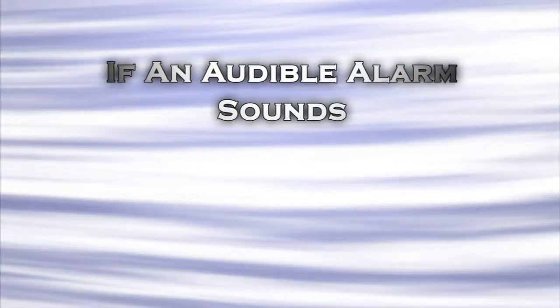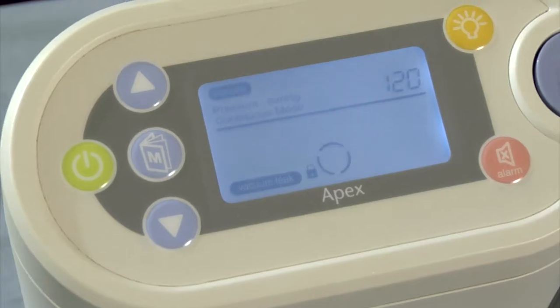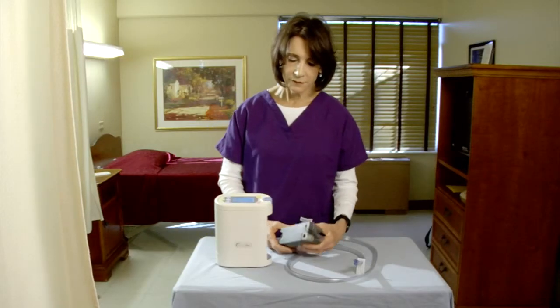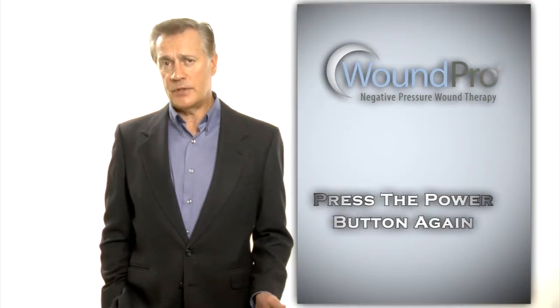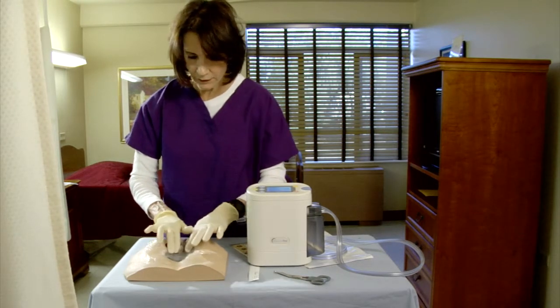If an audible alarm sounds, check the display to see what alarm was activated. If the vacuum leak logo is displayed, check all connections to the dressing. Make sure the canister is fully seated to the unit. Press the power button again. If the alarm sounds, check the dressing for any leaks that may have occurred during the dressing change.